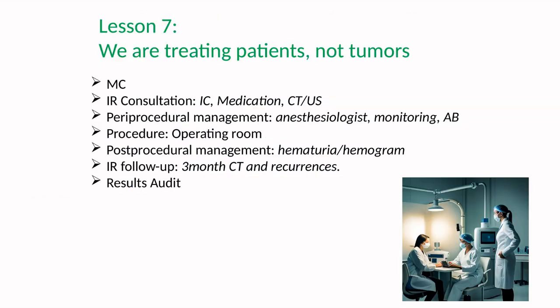But always consider microwave ablations as surgical interventions. Be at the multidisciplinary committee. It is mandatory that the patient is referred to your IR consultation. It's the place to explain the procedure to the patient, give the informed consent, and check with an ultrasound the visibility and access to the lesion. Avoid non-prepared ultrasound rooms, instead use the operating room.